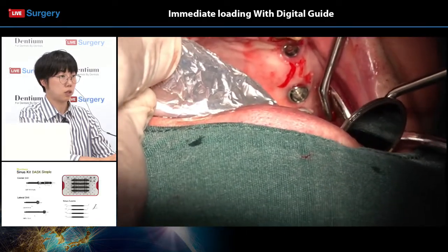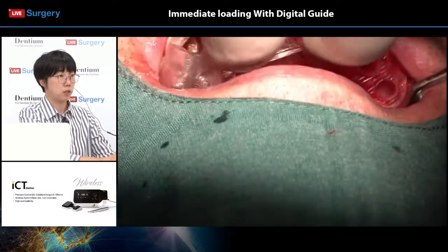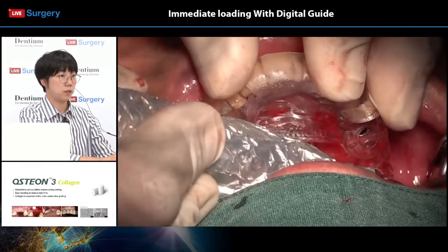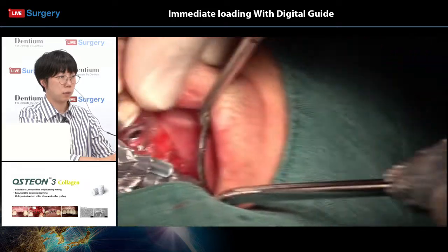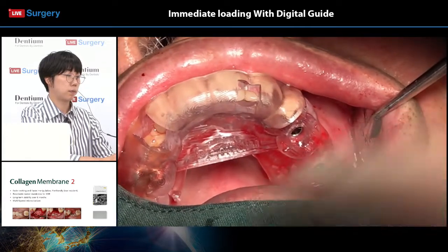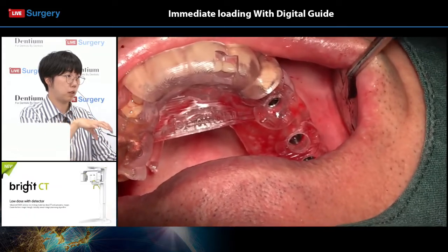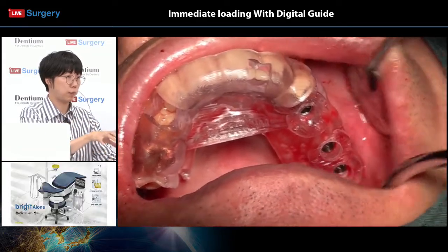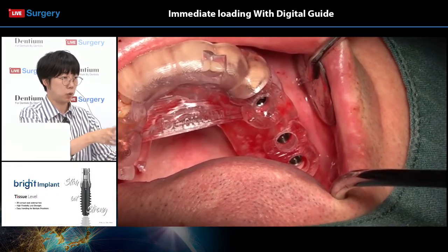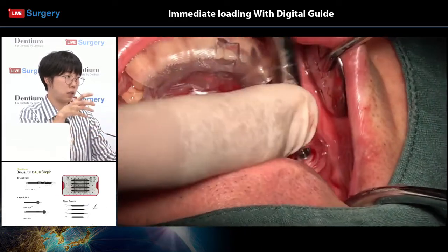It's because the patient doesn't have enough mouth opening, and the implant fixtures get stuck in the guide. You can place your implants first and finish your drilling by repositioning the guide, like you're seeing now. So please make sure that your implants go passively into your prepped bone area. If it doesn't, it would get stuck in between in the process. So in those cases, you can just take it out and retry.